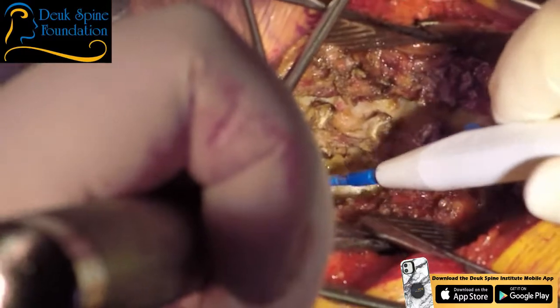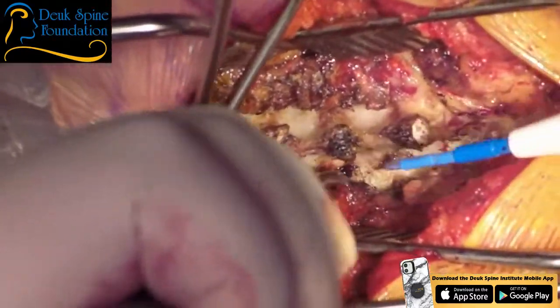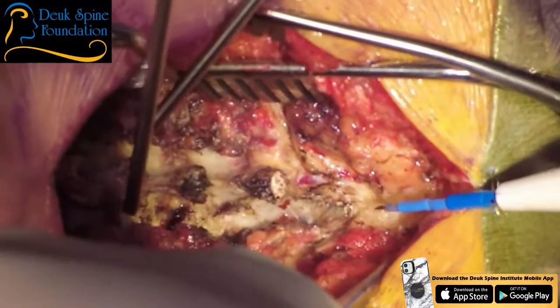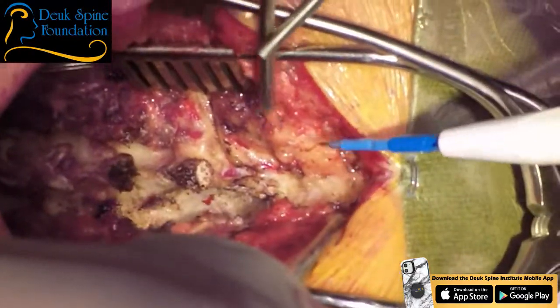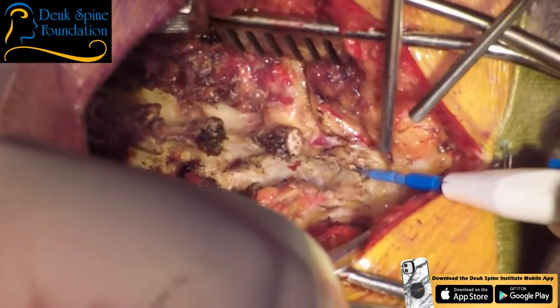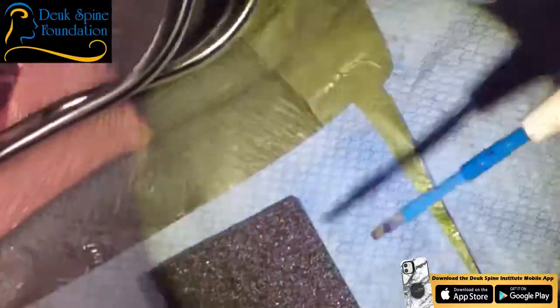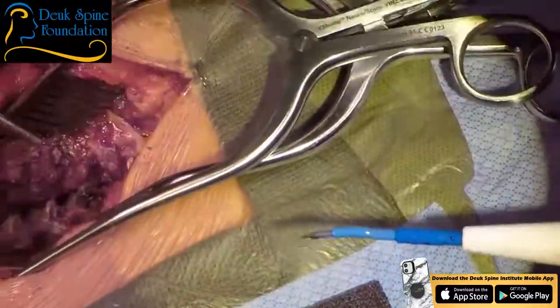I want to try to preserve C2-3. So 3, 4, 5, 6, 7, T1, and then we're going to get down a little bit deeper, lower to T2. Let's get your side, and then we can reposition our retractors again.